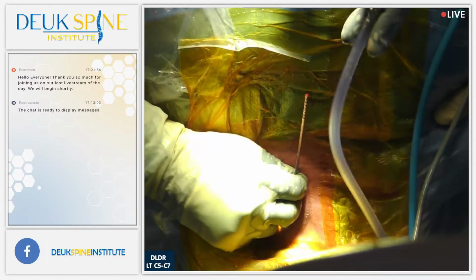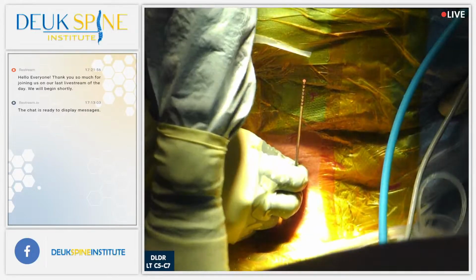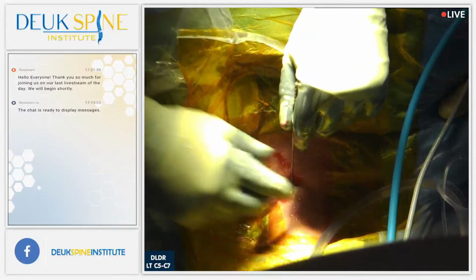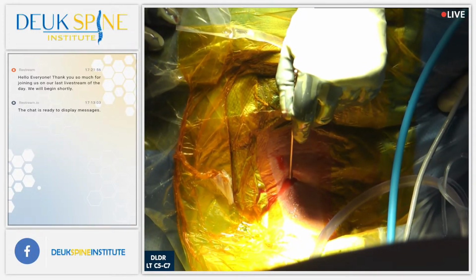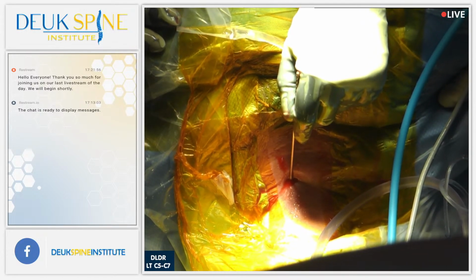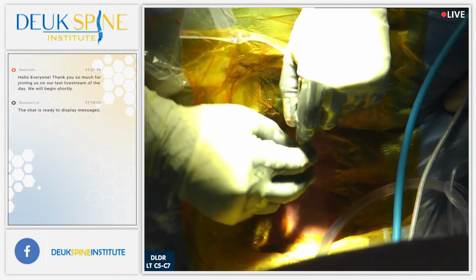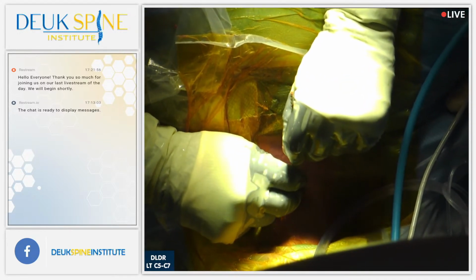Again, I was telling Luis our easiest surgery was supposed to be our hardest surgery today. It was a posterior cervical fusion. All right, that looks better. Very good. All right, 2, 3, 4, 5, 6, 7. All right, let's go ahead and we're going to move out. Nobody shake the neck. Keep it steady.